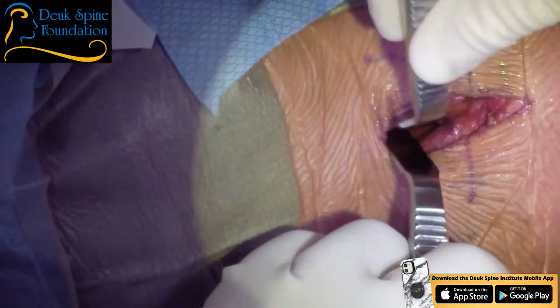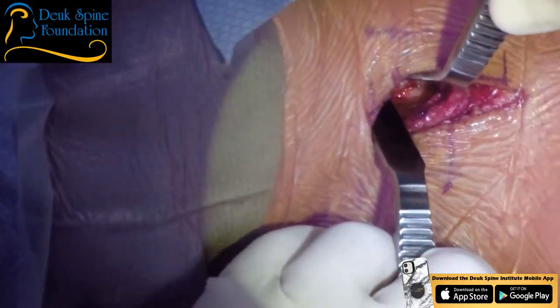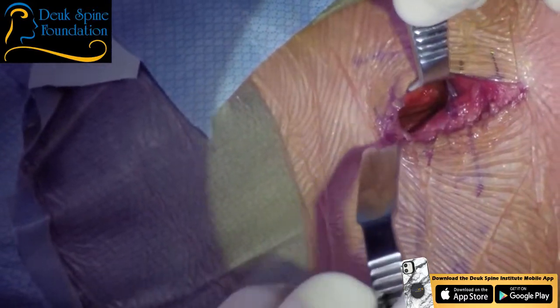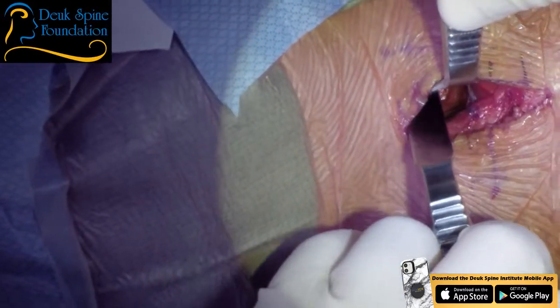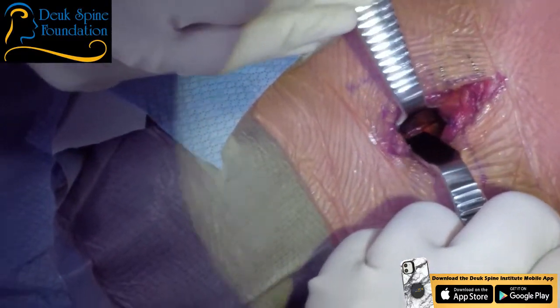Let me see. We know that's 4, 5 there. We want to get way down here. Be honest with you, a lot of surgeons wouldn't even do surgery on a patient that's this thick. Hold this here, because it's just so difficult to do.